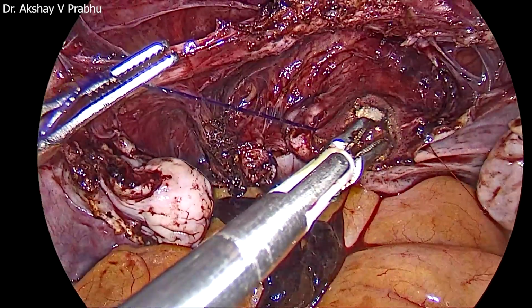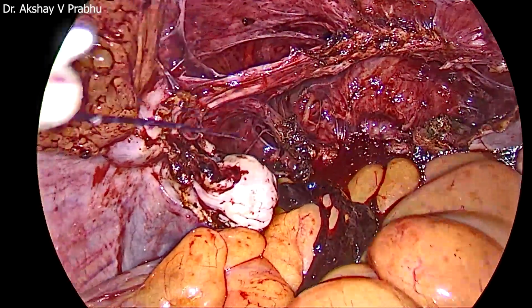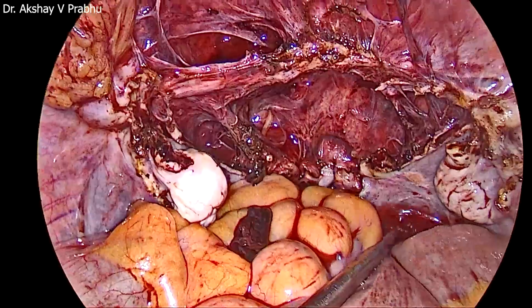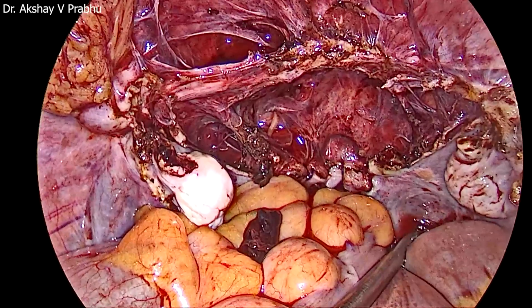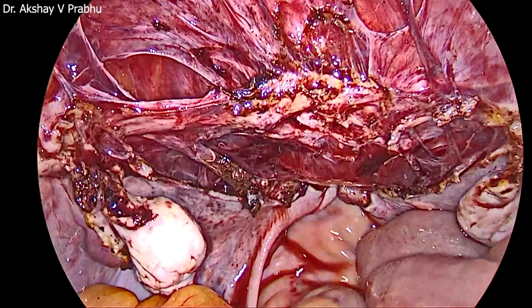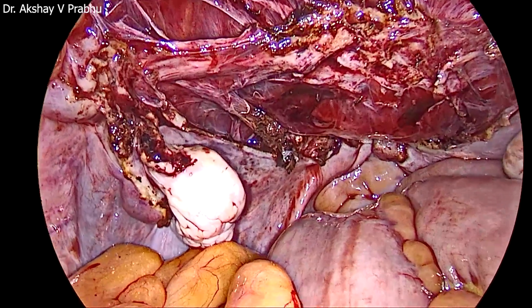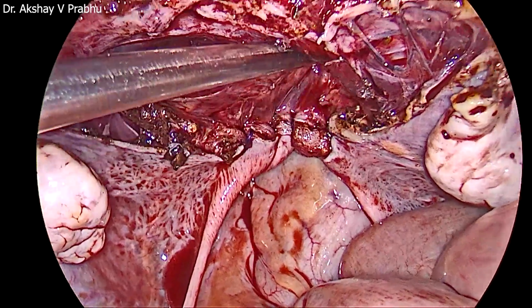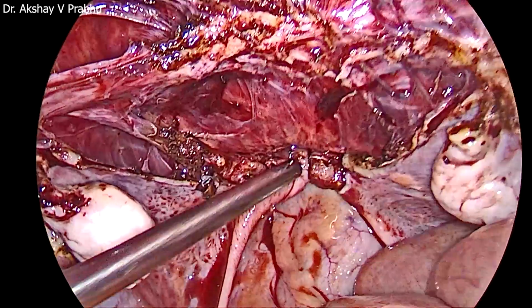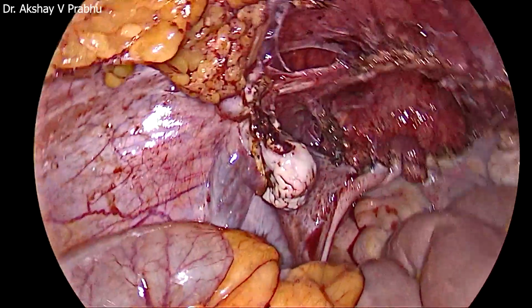Just cauterizing the right uterine end to be doubly sure. Now you have given a wash. So in these cases, always do the methylene blue test. I think we have done it in this case, may not be demonstrated in the video. Yeah, it has been done actually. We just do the methylene blue test, see if there are any micro leaks of methylene blue dye. If not, then you can be doubly sure that there is no injury to the bladder.